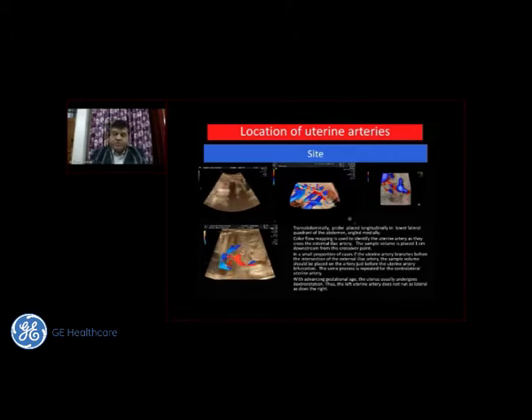But in a small proportion of cases, if the uterine artery branches before the intersection, the sample volume should be placed on the artery just before the uterine artery bifurcation. So the same process is repeated for the other side. But please also remember, with advancing gestational age, the uterus usually undergoes dextrorotation. Thus, the left uterine artery does not run as laterally as does the right.